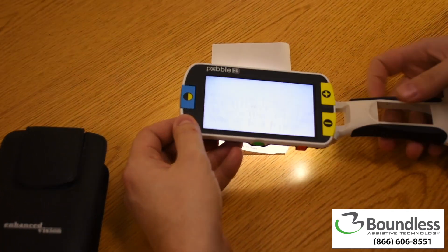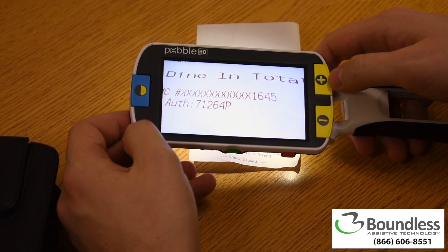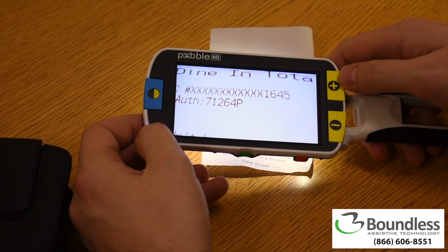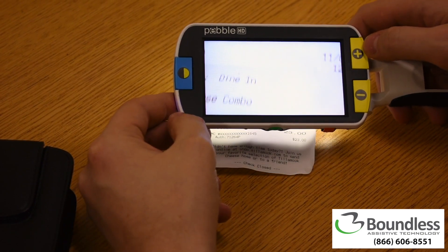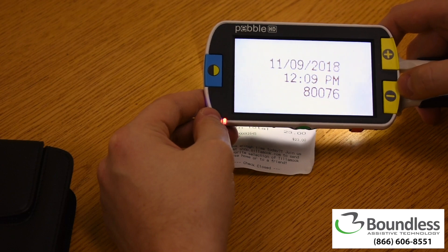Let's take a closer look. Operation of the device is very simple. The buttons closest to the handle control magnification — the one on top increases magnification, and the one below it decreases magnification.